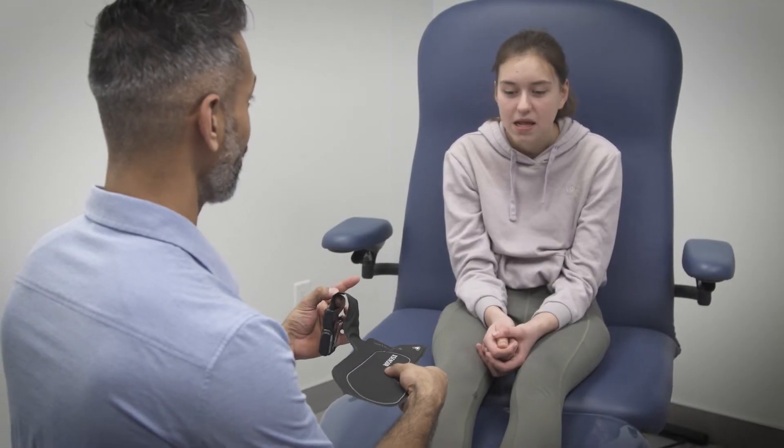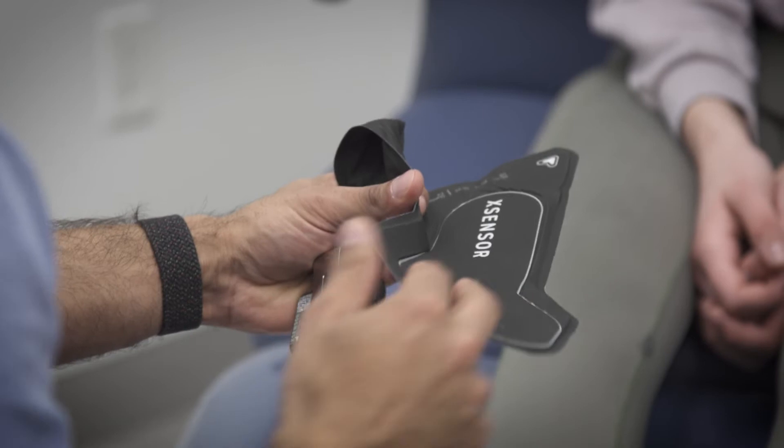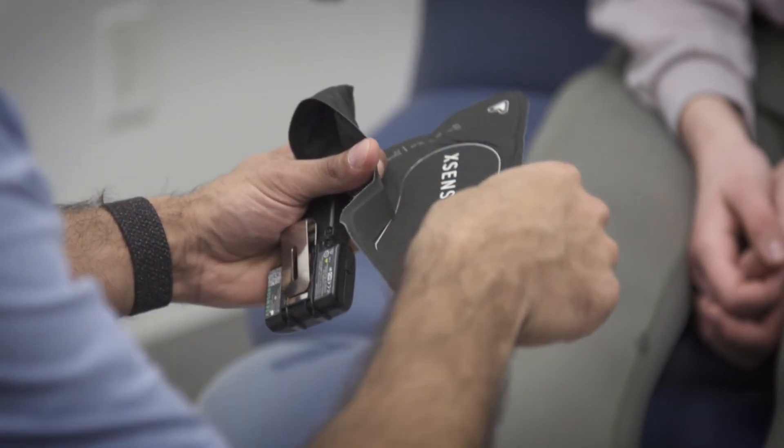The sensors are thin, flexible, durable, and undetectable to the user, ensuring natural motion for continuous use.